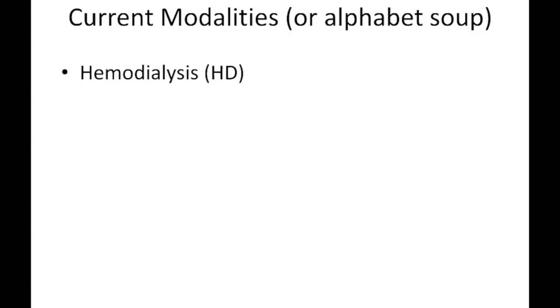So before we jump into those things, it's probably worth reviewing the number of terminologies that's out there to refer to modalities that are dialysis or dialysis-like, or at least what we call extracorporeal therapies, taking blood out and processing it.